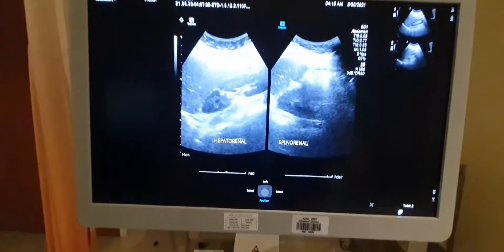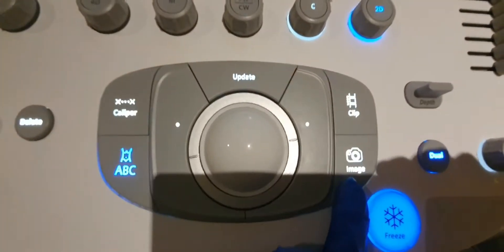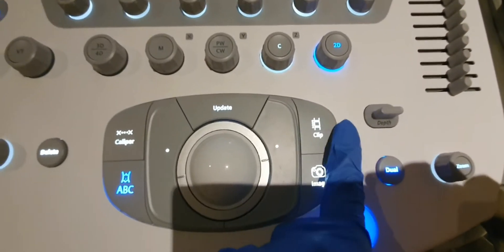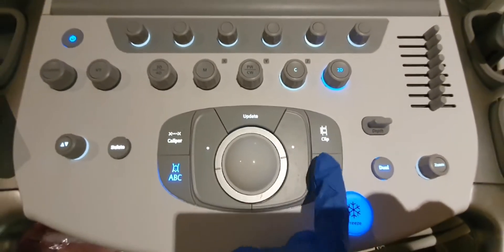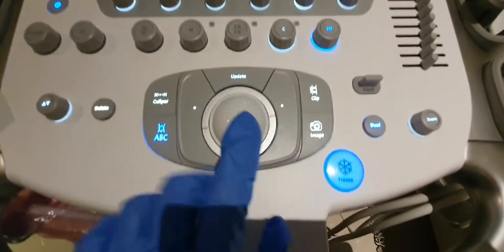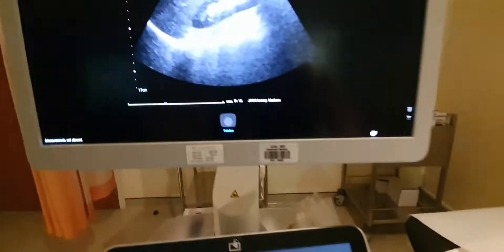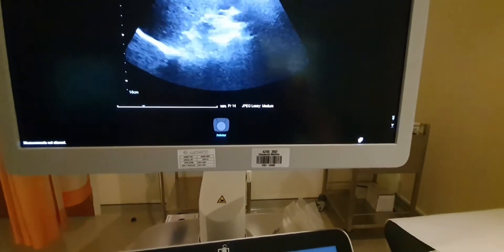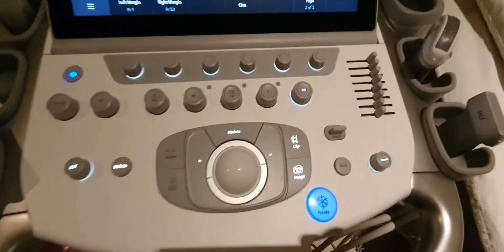If you want to save an image, just press the image button. If you want a video clip, press the clip button — it will capture just a few seconds of footage.